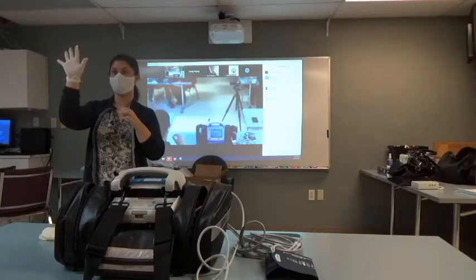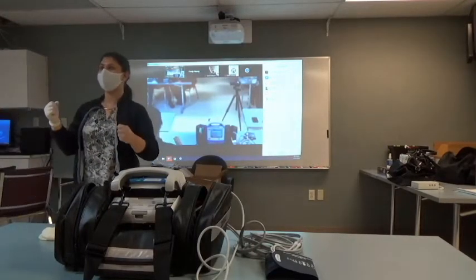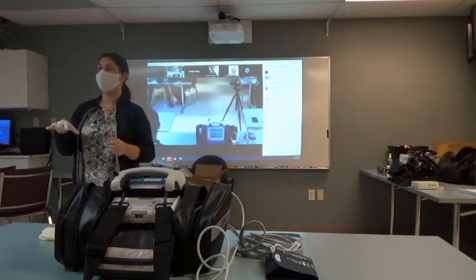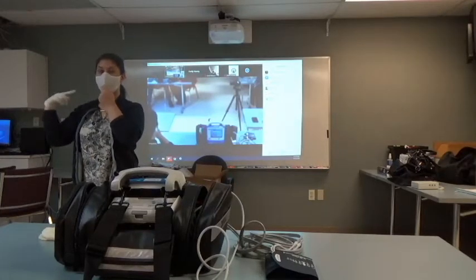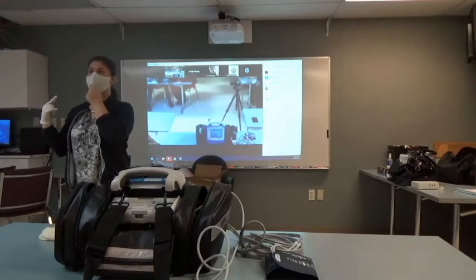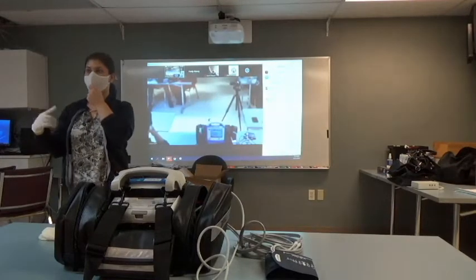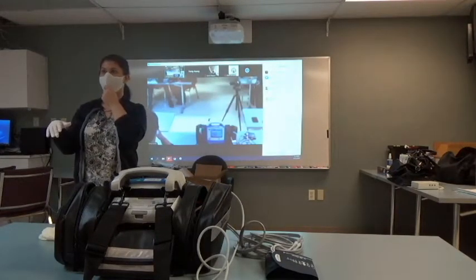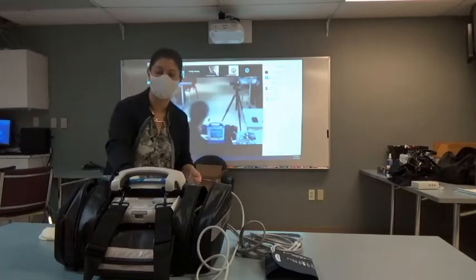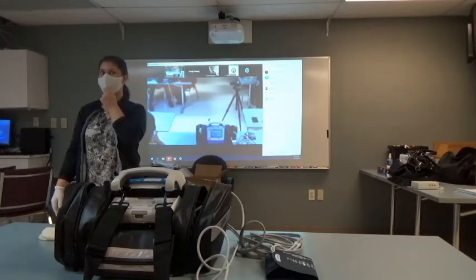You said every 5 minutes? Yes. Every 5 minutes, so let me just bring you guys back for just a second. Since we're going to be changing the configuration file to where it is going to be powering on in automatic mode, I want you guys to be mindful that at 5 minutes, it's going to just start to inflate. If you need to disarm it, the blood pressure button is your override button, okay? So that will disarm it. If you want to take them more frequently for some reason, you can press the blood pressure button, and that is another way to override as well, to take them more frequently. Does that make sense to everybody?